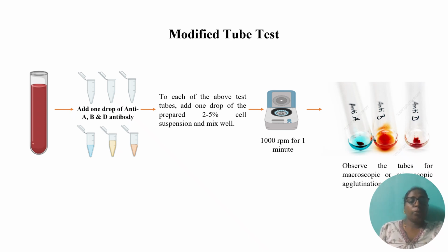The ABO blood group test tube test is a manual, gold standard laboratory method used to accurately determine the exact blood type, either A or B or AB or O, and also the RH blood group, either positive or negative. It involves two complementary parts: forward grouping, testing your red blood cells, and reverse grouping, testing your serum or plasma.